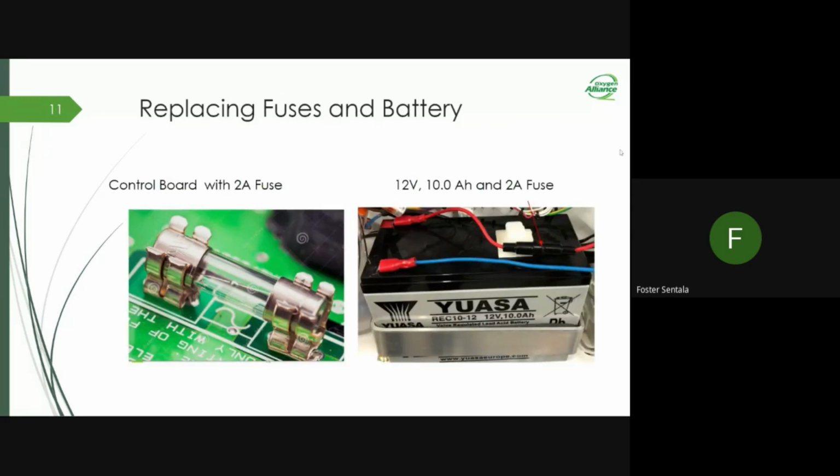Moving on. On this slide, I would like us just to have a look at some of the things that might need to be replaced with time.